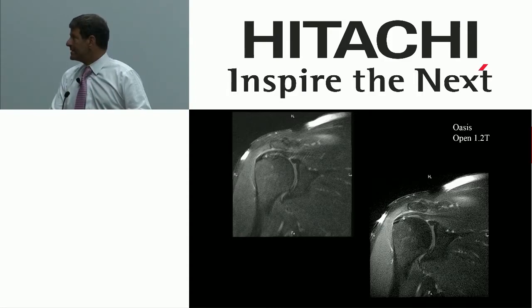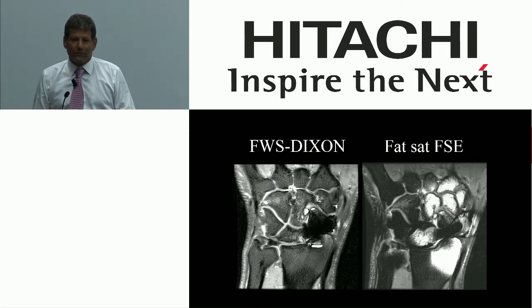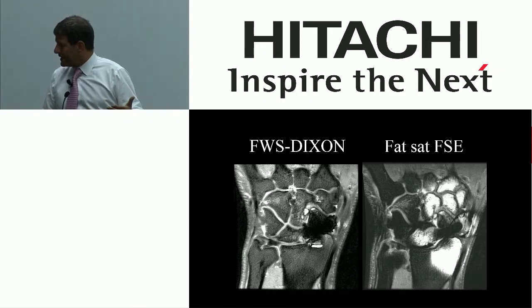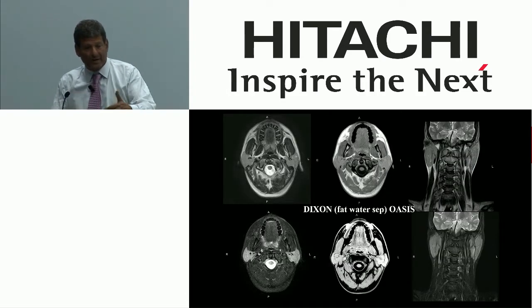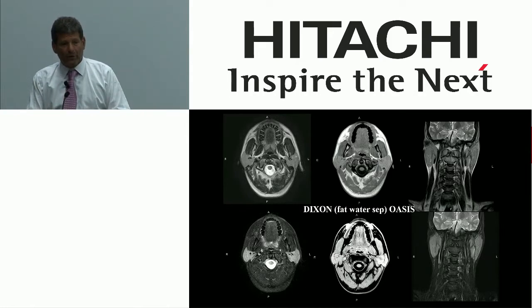Here you see a typical dilemma when you fat suppress, particularly when there's metal around: the fat suppression fails, and your image becomes completely non-diagnostic. If you can improve the fat suppression around metal, you can see some of the disease that you'd like to see. And these are these Dixon techniques I showed you beforehand, these fat and water separation techniques. Aside from the 2-for-1 factor, they give you perfect fat suppression in circumstances that always fail without them.